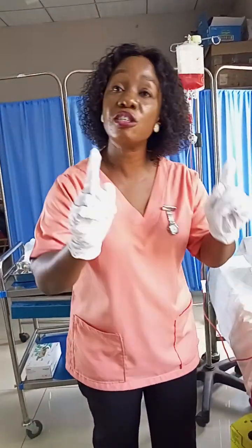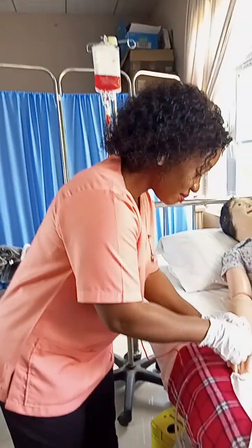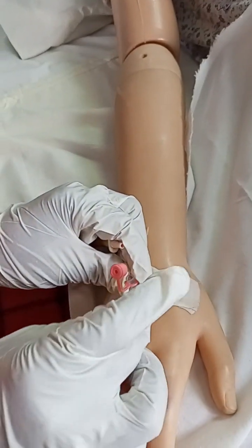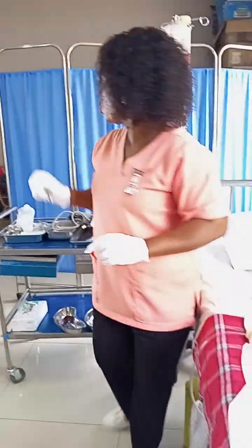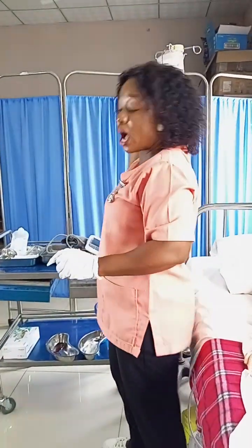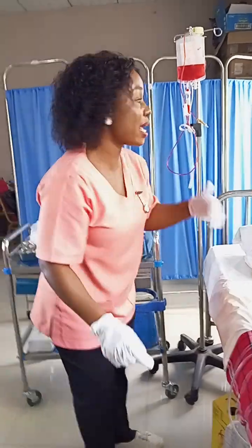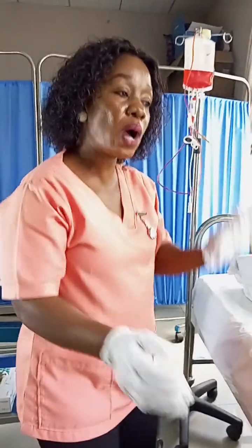The patient did not have any reaction, so I disconnect the blood giving set, close the cannula, and hang it. Now, your responsibility as a nurse, you don't have to discard this blood bag. You have to leave it. Each hospital has a place. So during exams, explain to the examiner, I will not discard this blood bag. I will keep it in the place where it is kept for blood transfusion.